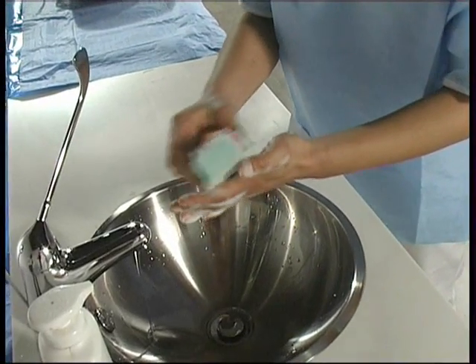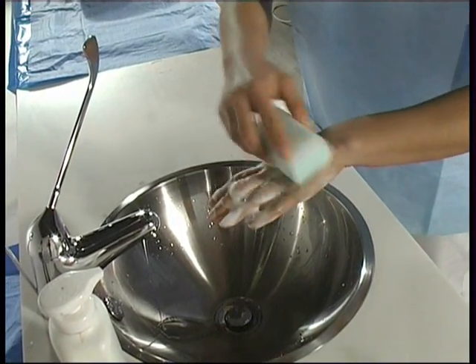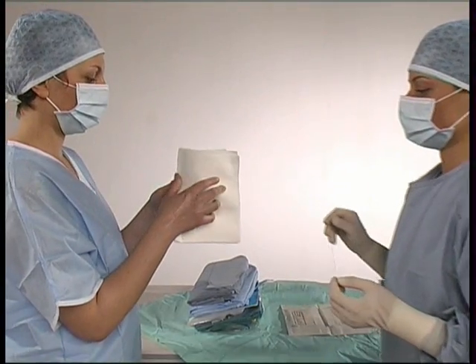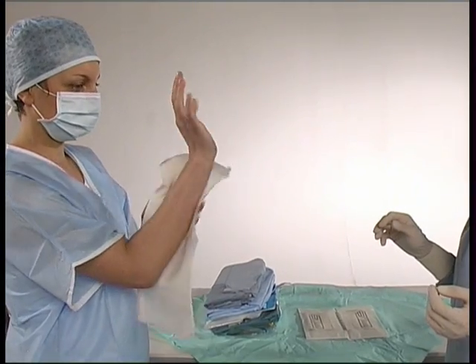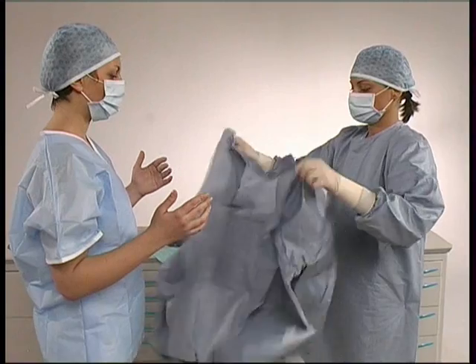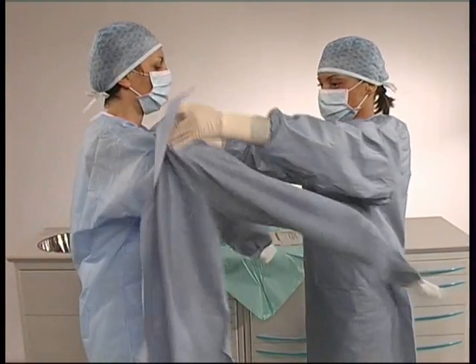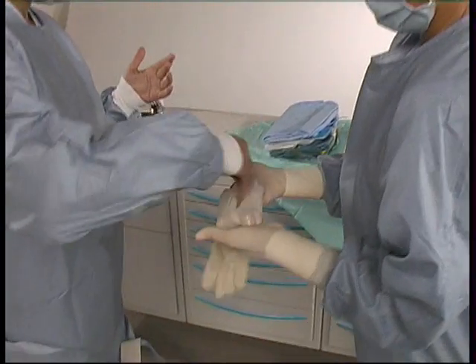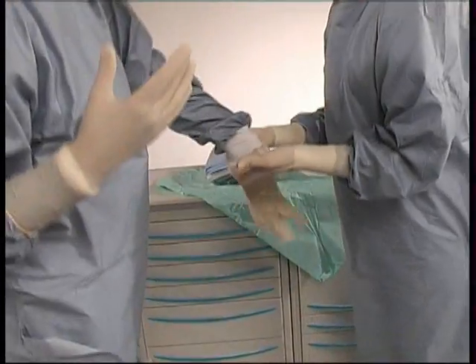The second assistant and the doctor proceed to wash their hands and dress. Having completed the hand-washing and drying procedure, the preparation is completed with the assisted dressing of both assistant and doctor. In this case, the sterile assistant fully unwraps the gown, allowing the other operator to put his hands in the gown arms and out at the cuffs. The already sterile assistant also helps with putting on the gloves and closing the gown.